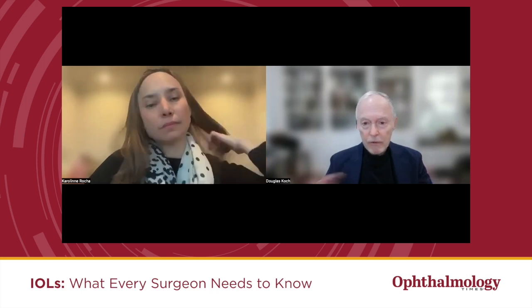I've heard some discussion that occasionally surgeons have reported unhappy quality of vision with these lenses. Personally, I've never experienced it. But I am cautious, as you say, with irregular corneas, where something doesn't seem quite right. And certainly corneas with a lot of already negative spherical aberration or a lot of coma, maybe you're better off with a more uniform optical surface. But it's been a wonderful addition to our practices. Yes, yes. I think again, it's a premium option for eyes that are not candidates for the full vision range lenses. I think the patients are very happy with this technology.